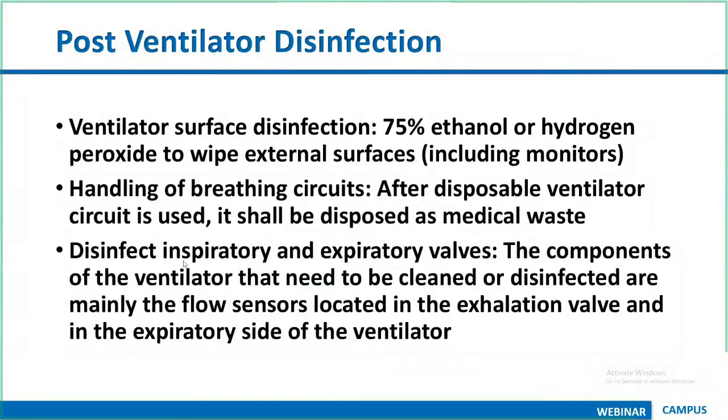The ventilator will usually have an inspiratory and an expiratory valve. The components that need to be cleaned or disinfected are mainly the flow sensors located in the exhalation valve and the expiratory side of the ventilator. From the inspiratory side, you are pushing the air out, so there is no chance of the machine getting infected.